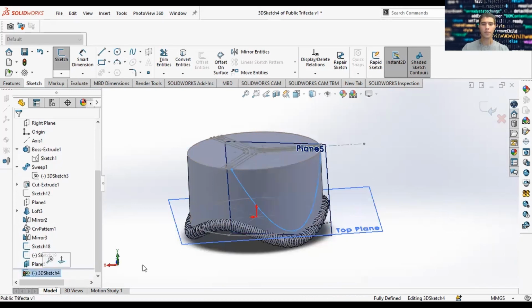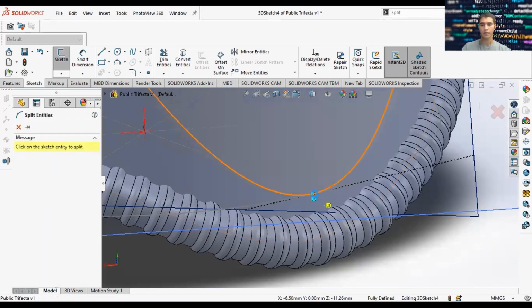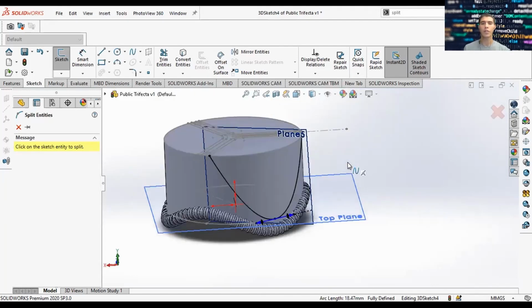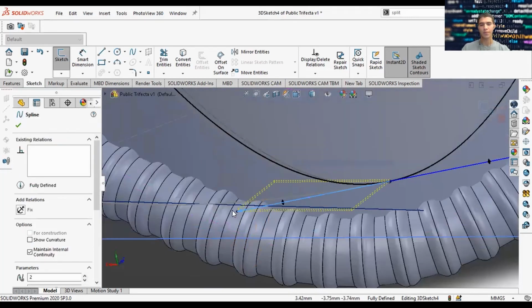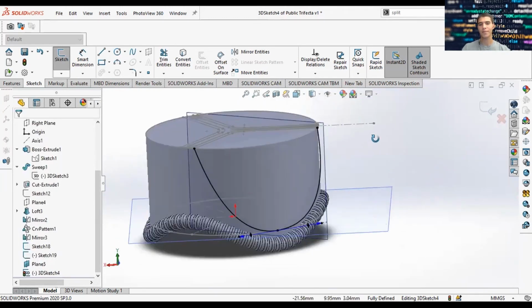Let's go ahead and go to 3D Sketch and edit this curvature shape. By splitting entities, we're saying, hey, we want to split this spline. And now that the spline is split, we're going to be able to access that curvature. So we're going to stretch this curvature even further, make it a wider spline. And now we made it wider. Let's go ahead and click accept.